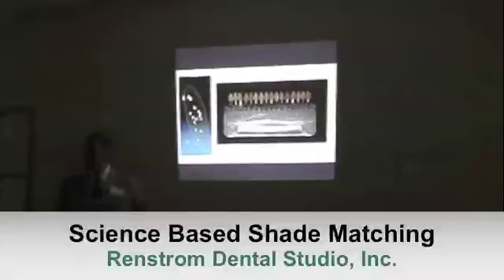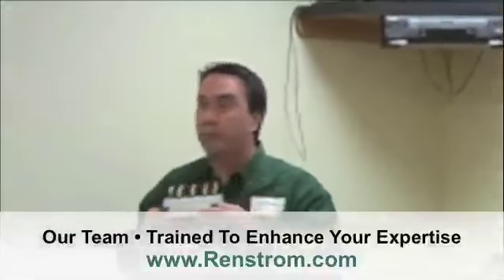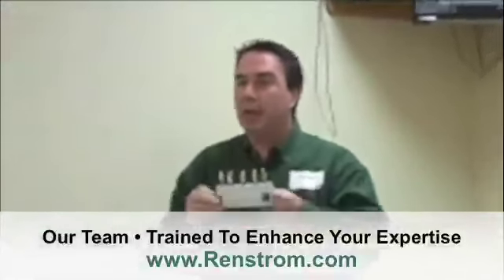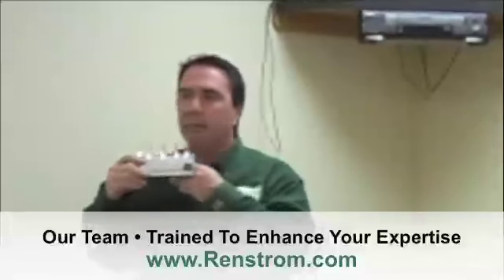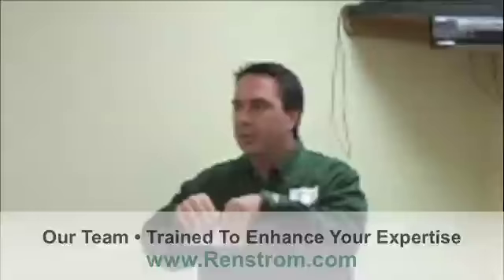Now evidence-based dentistry tells us there's a better way. A lot of the time, on the average patient, you're done quickly, though there are always exceptions where you're going to fine tune it big time. But there are times where it could be that quick. Value: no, darker, darker, darker, okay, right there. Okay, what's my saturation? When it is orange, not reddish or yellowish, you're done.